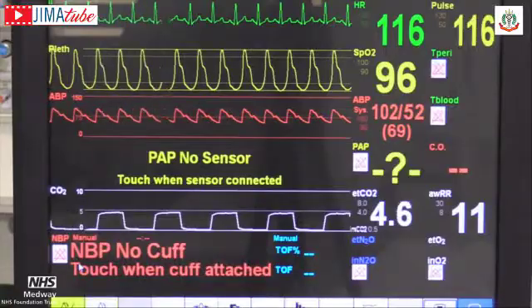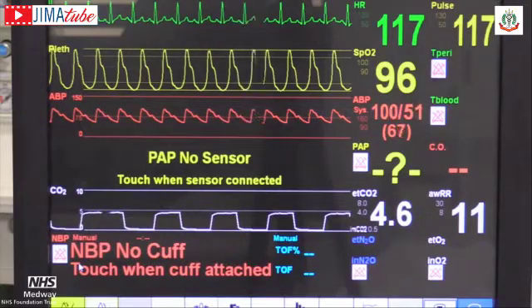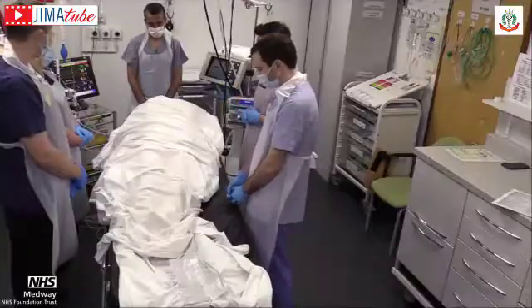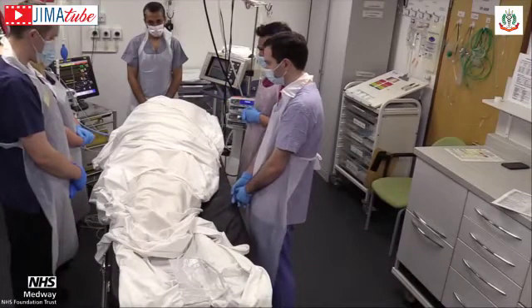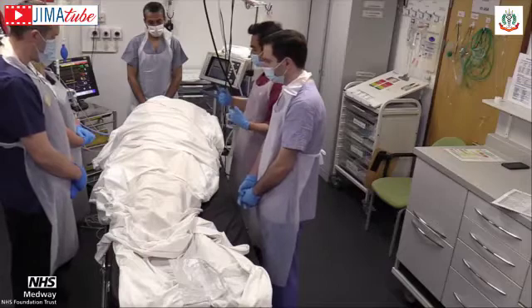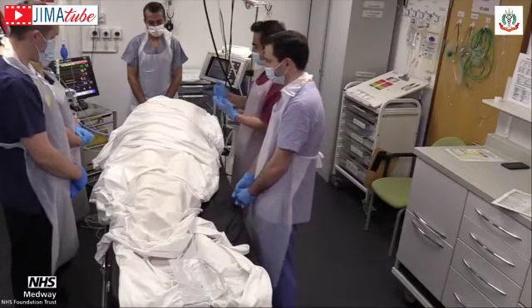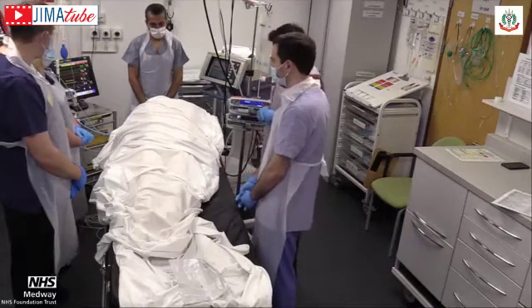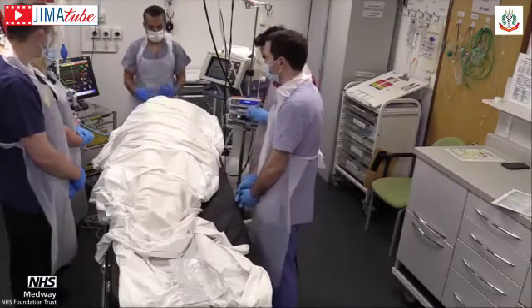Now that we have got improvement on oxygenation, we are happy that we can give him a trial on his back, and it's been 16 hours as well, and therefore we have to now safely supine him, and Vipul again will lead us on that. So again, like as we proned him, we need to deprone him now.